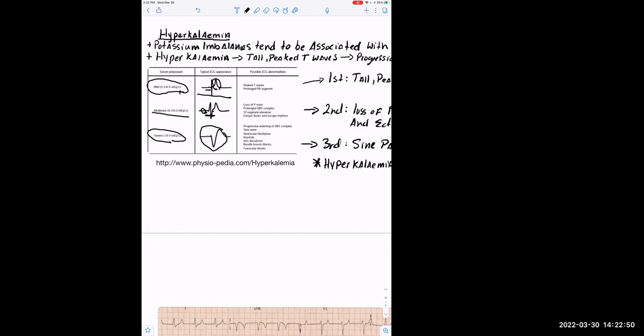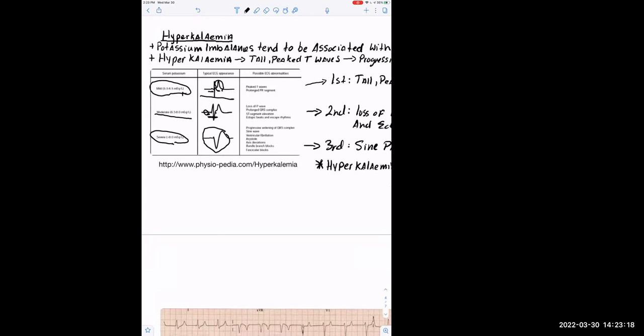Those of you that may take electronics, you see that on an oscilloscope. Well, the heart can do that too if you get the potassium up high enough. And that is usually followed by a ventricular fibrillation as our hyperkalemia gets worse, the heart becomes more exposed to the high K levels. You'll see that QRS continue to stretch out, and they'll revert into a ventricular fibrillation or even a ventricular asystole.